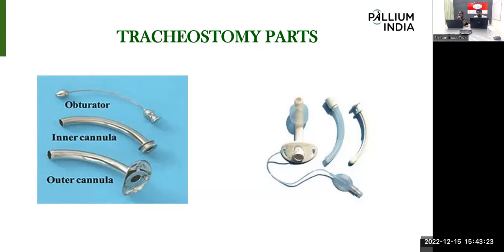So we are waiting for your answers. So Jafar said to secure the airway. Prevent the dislodgement. Okay. Because the cannula gets blocked, while removing the inner cannula, the blockage is cleared.